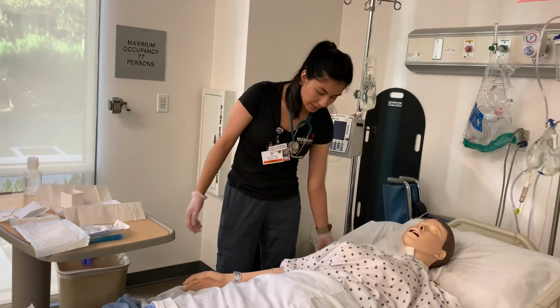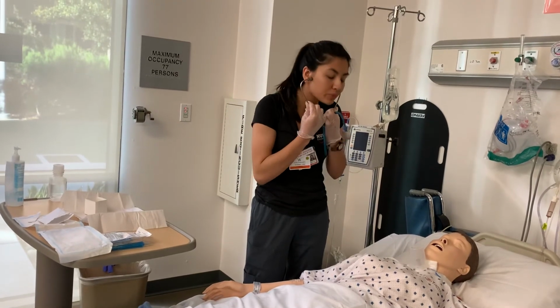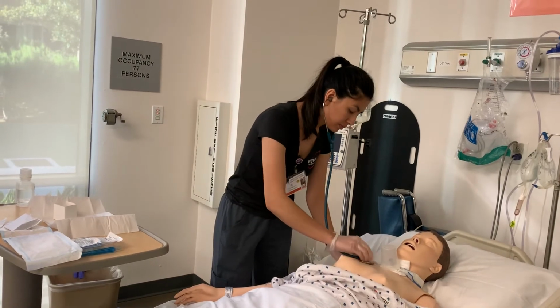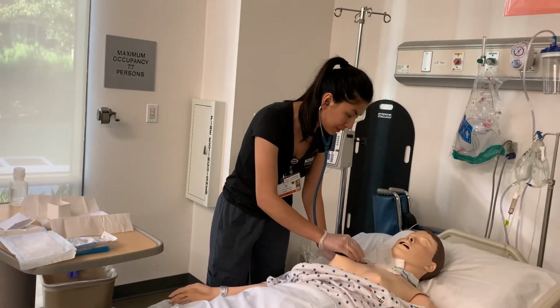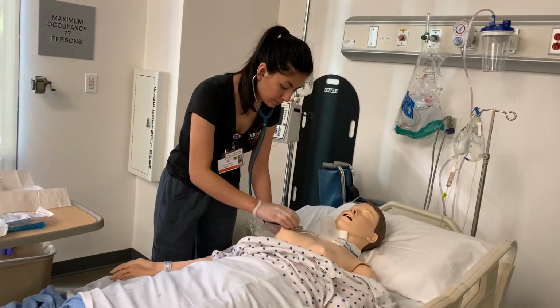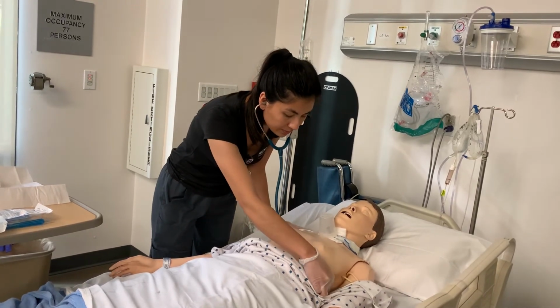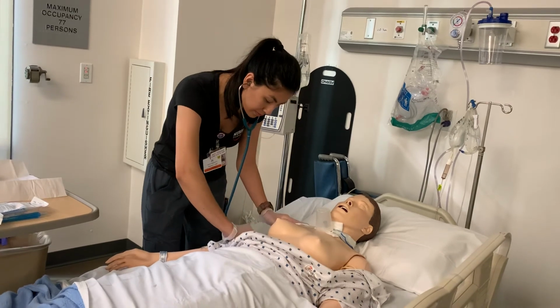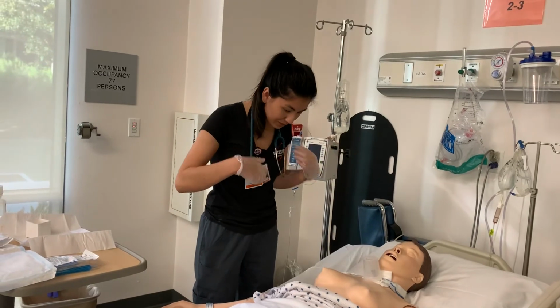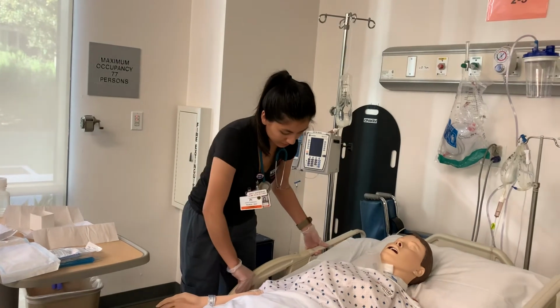And then I'm going to go ahead and listen to her breath sounds again to make sure that she's improved. So just take a deep breath every time I move my stethoscope. Clear. Clear. Clear all the way around. Okay. And I'd have her sit up and I'd auscultate posteriorly as well and make sure she's okay. All right, Jane, and then I'm going to just lift this up for now.